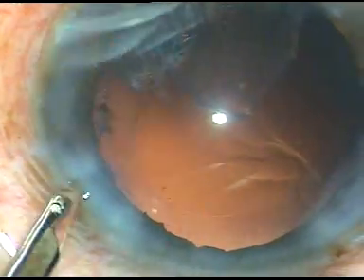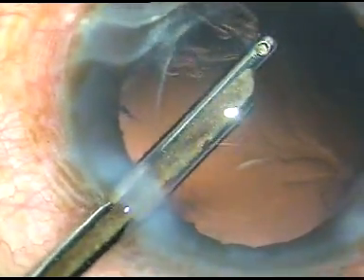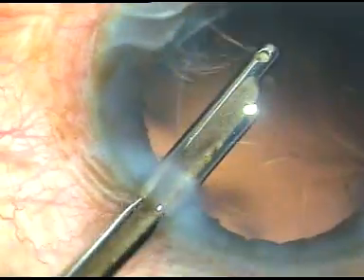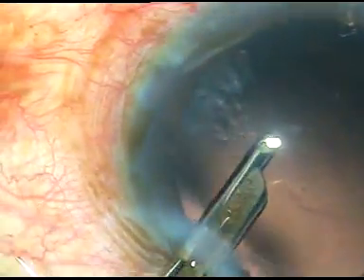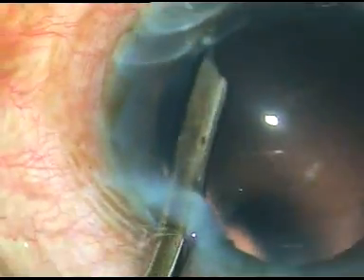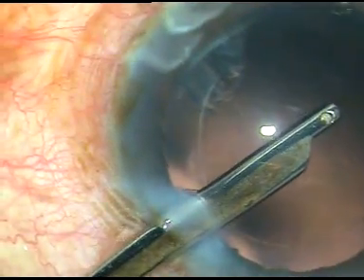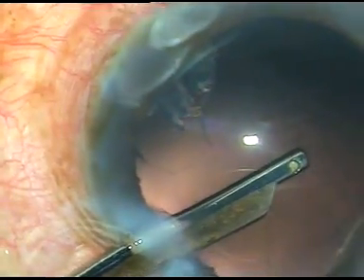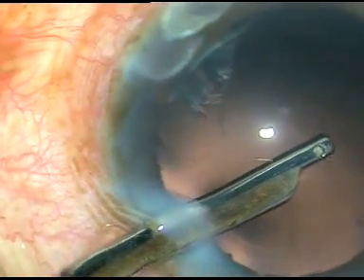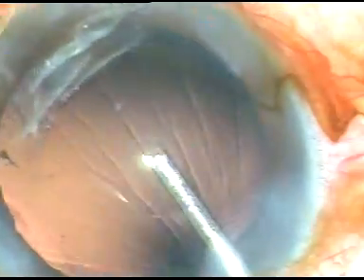Now once I have done enough irrigation, I try to aspirate this. It comes, but a little bit of it. Here it is. I find that I'm pulling on some vitreous strands. So what I do is, when I realize that I'm pulling some vitreous strands, I go onto the other side, regurgitate, backflush, remove the strand from the port and then come out. Now inject visco again.